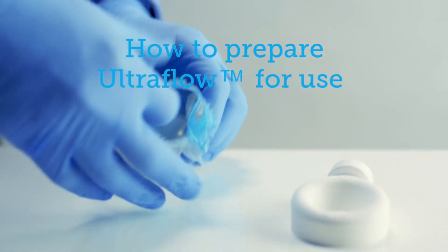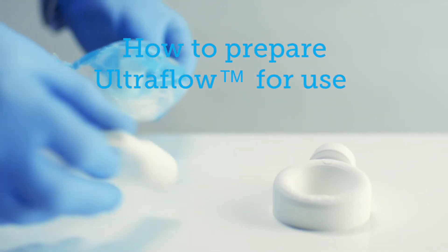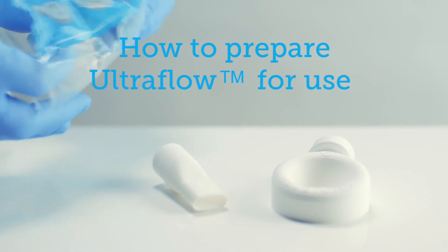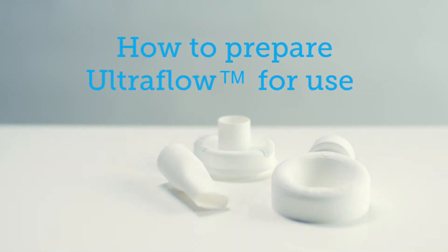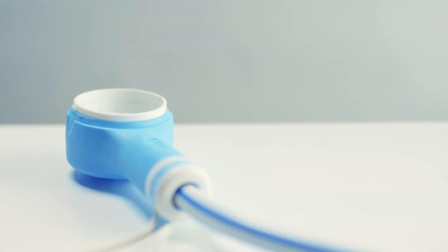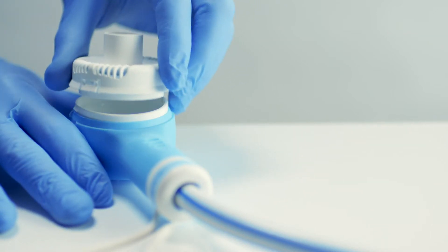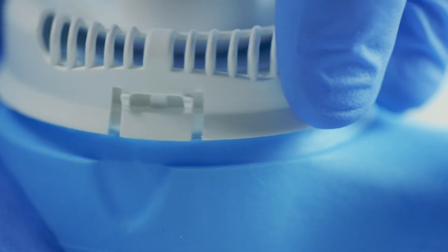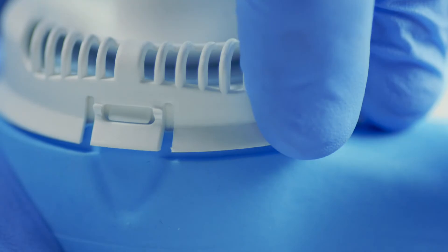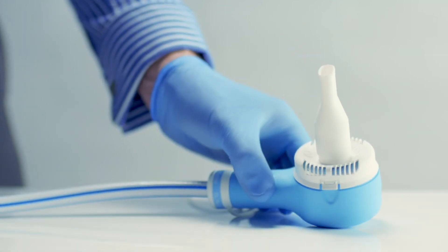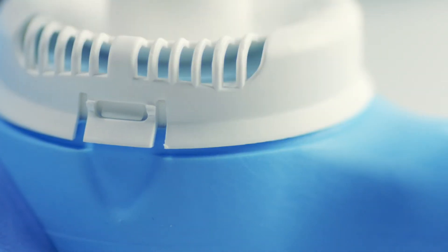This is how to prepare Ultraflow for use. Take an exhalation valve and place it on the demand valve. Rotate until the clips engage and press home. You should hear it click into place. Check it's securely fitted.